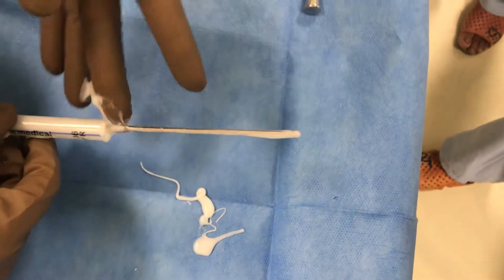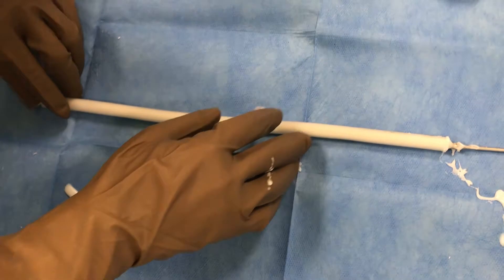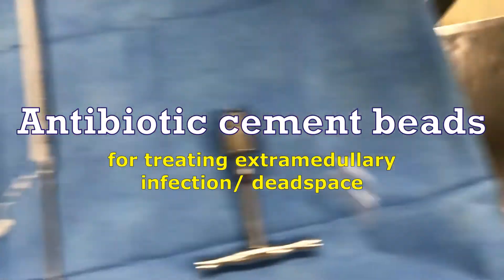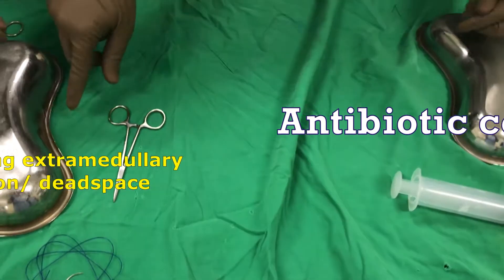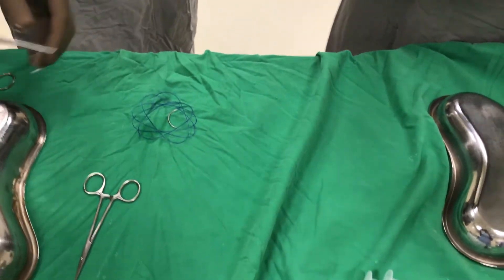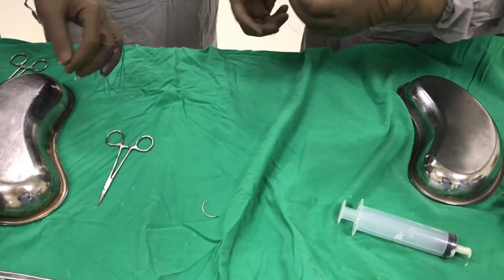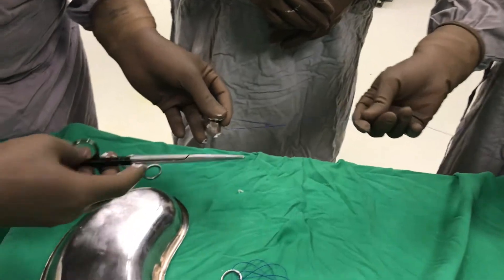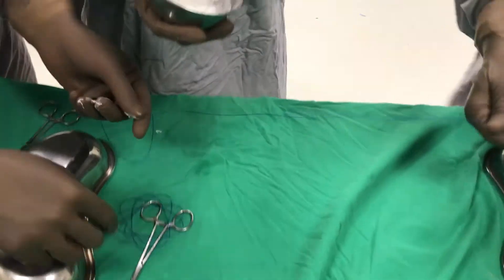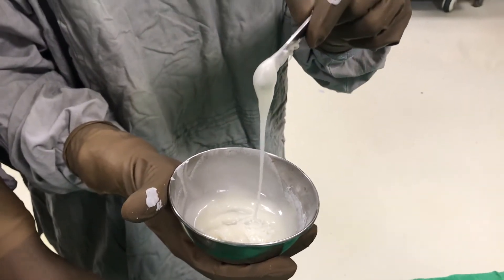Now let it settle down for a little bit. We want to know when the cement is in the setting phase — we will cut it out and demonstrate that later. Now we go and prepare the cement beads. These are prolene sutures which will be twisted together — a pair of sutures. The needles are cut and they are intertwined together to provide a firmer structure on which the beads can be made. You can see the cement has started to set up; look at the consistency changing — this is a good time to prepare the beads.